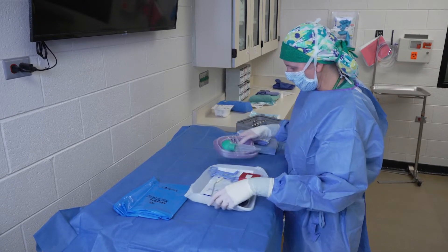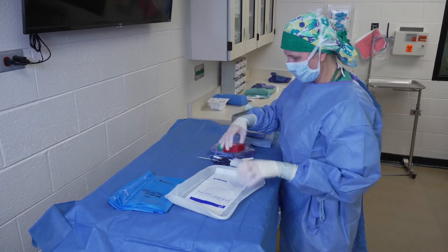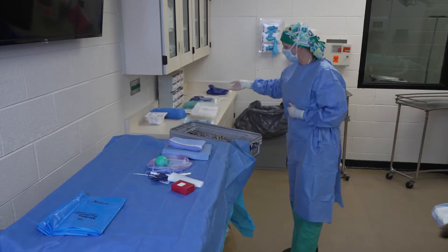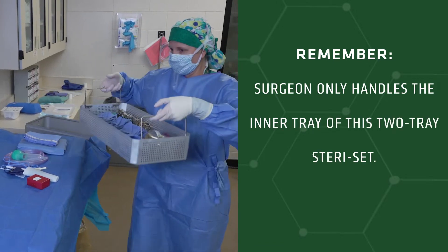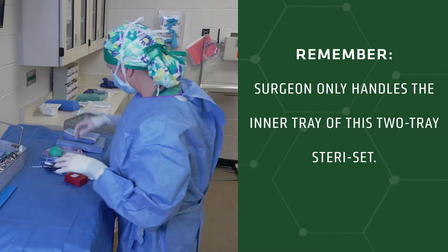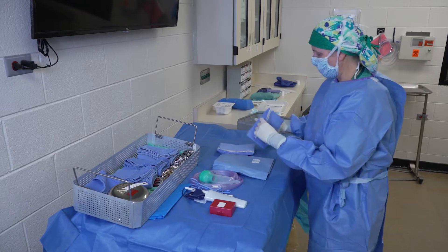We're going to get our suction hose, all of our little clips and suction tip. We've got a sharps container, and I'm going to toss that off to the side. My instruments are here — I'm careful to lift just from the inside edge, as this is all sterile — and I'll set those on the back of my table. Now I can get all of my drapes unfolded and ready to go.